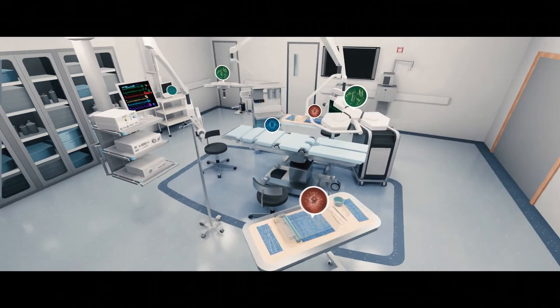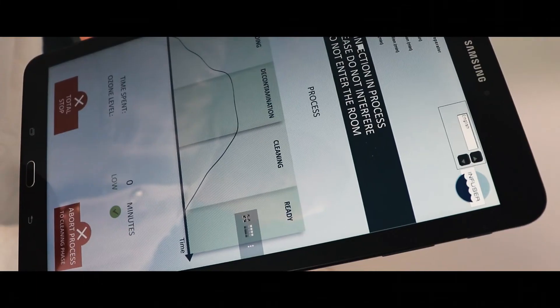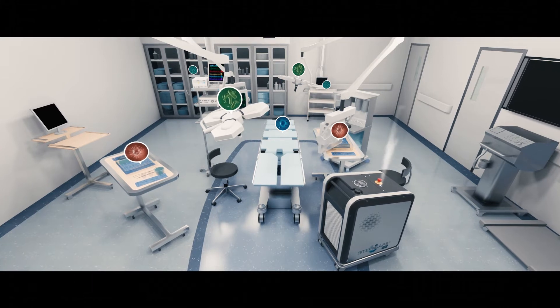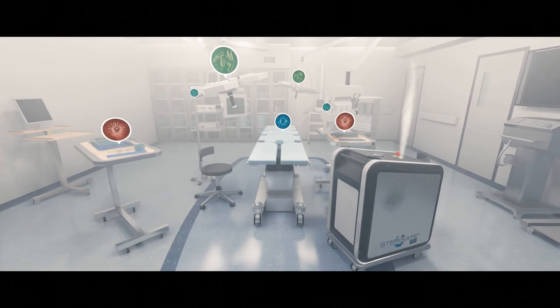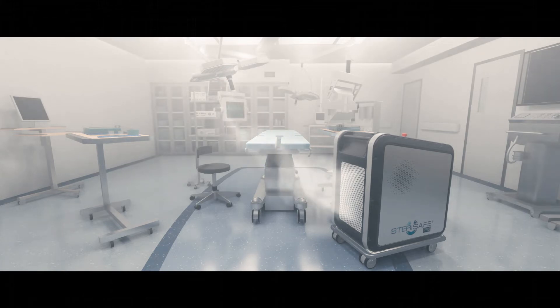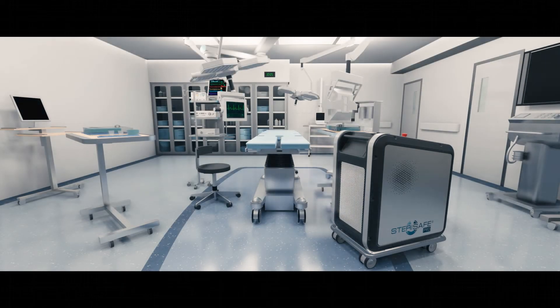During the disinfection cycle, you will be able to monitor the entire process on a tablet. Step 5: Sterisafe Pro will start by creating an atmosphere of ozone and humidity inside the room. Spreading to every corner and crack of the room, the ozone gas will effectively disinfect all areas. Once the disinfection process is completed, the Sterisafe Pro turns the ozone gas back to oxygen again. During this process, the Sterisafe Pro will also purify the air and remove any harmful particles.